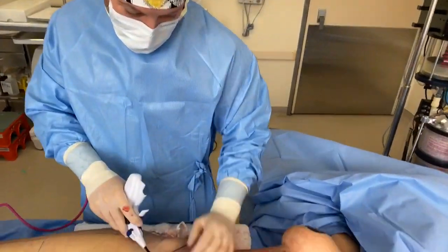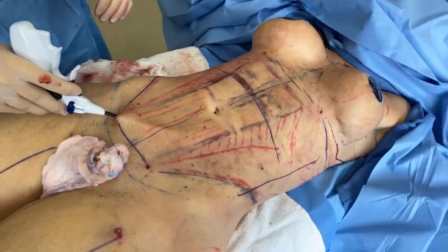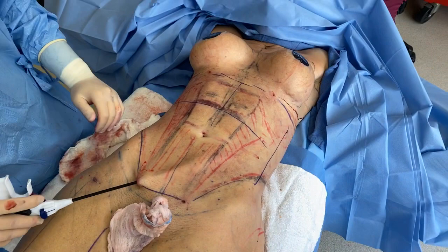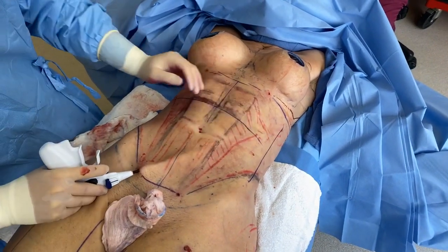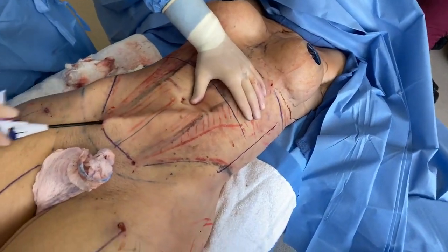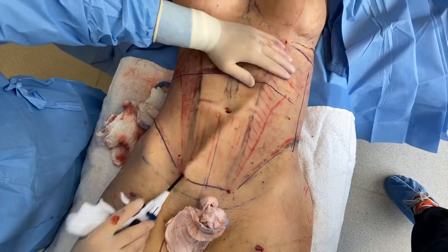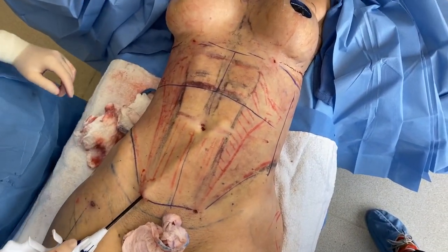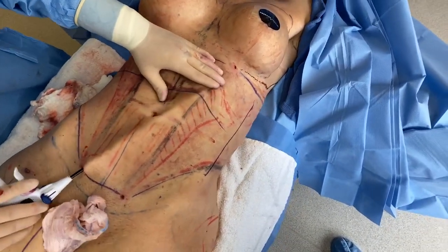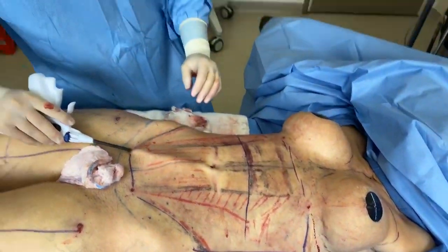Viewer asks: 'Can this help with back rolls?' It can sometimes, but you need those back rolls surgically removed — like the tummy tuck we're doing here. You can't always fix everything with the device alone. That's it for Renuvion — you can see how tight she is already. She wanted some abs, so we gave them to her. She is going to have a beautiful result. Stay tuned later to see the tummy tuck.